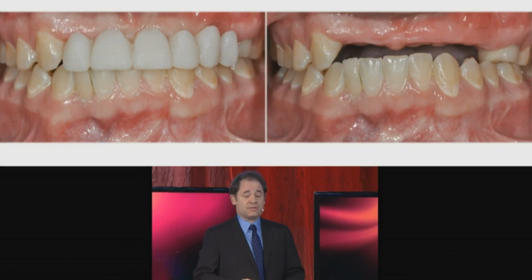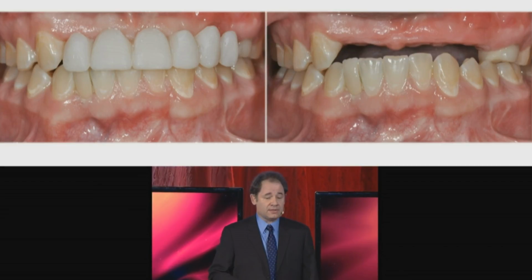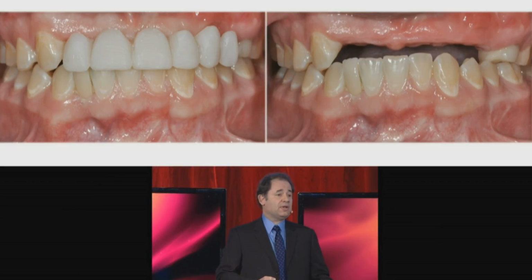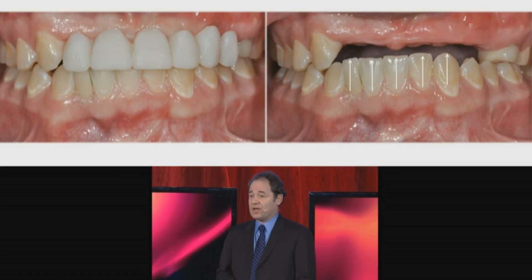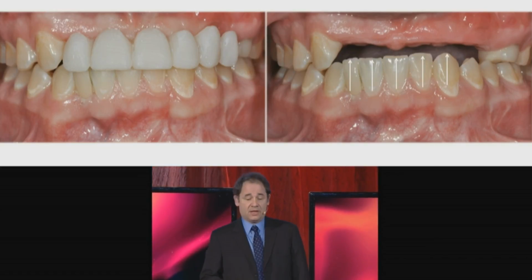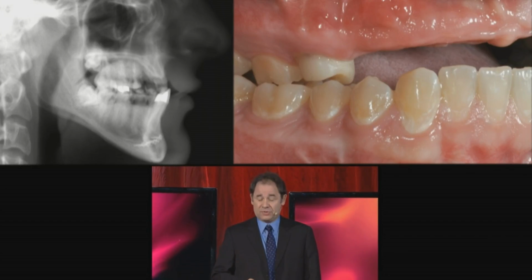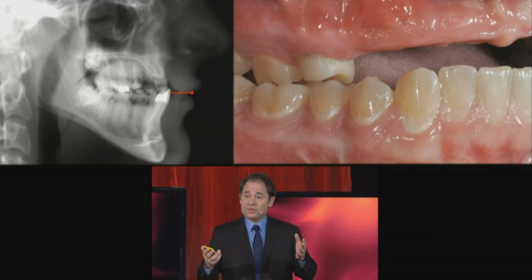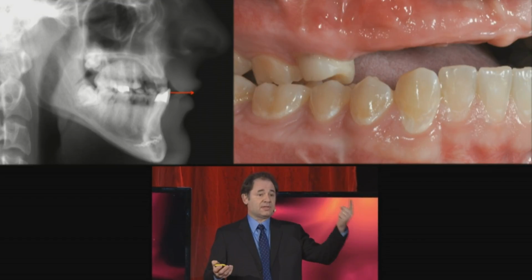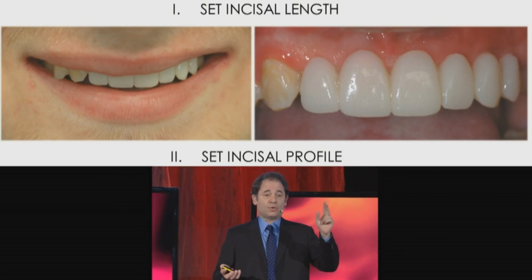This is a young patient. He needs 4 implants. He had 4 implants. He had a car accident. You can see a very irregular occlusal plane. You see that the lower incisors have super erupted. And not only have they super erupted, they also are very flared out. And we are going to follow step number 1, set incisal length. Step number 2, set incisal profile.